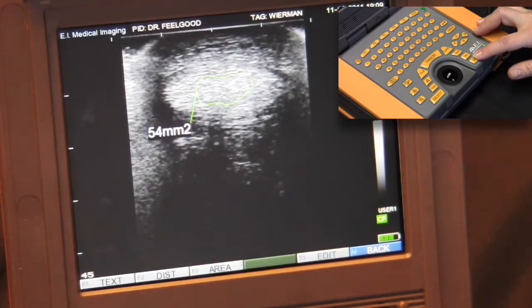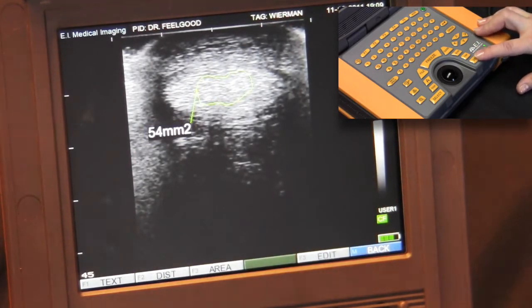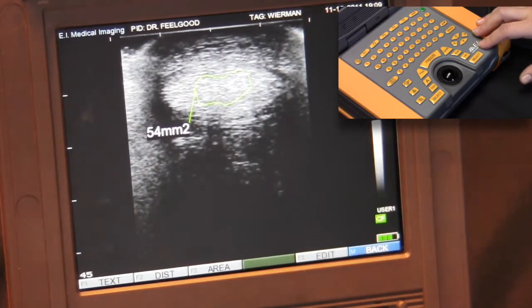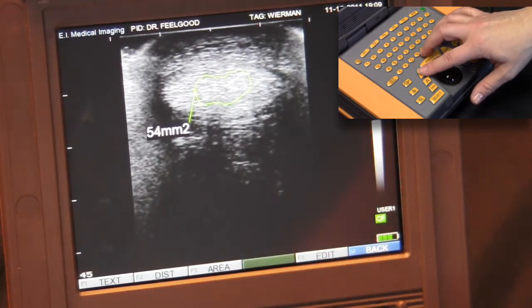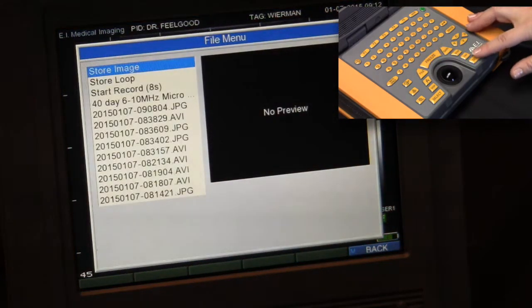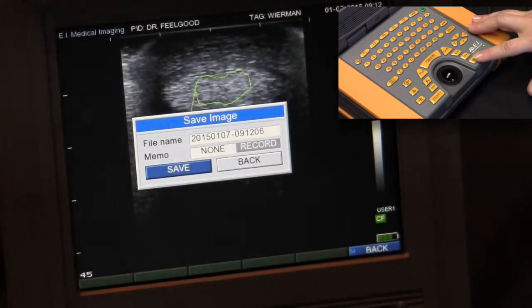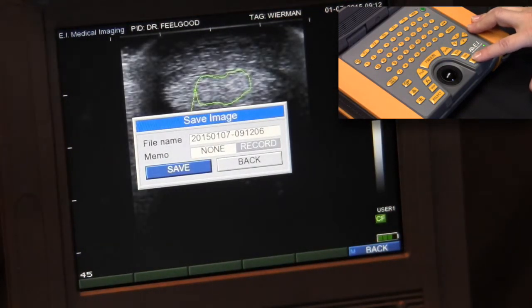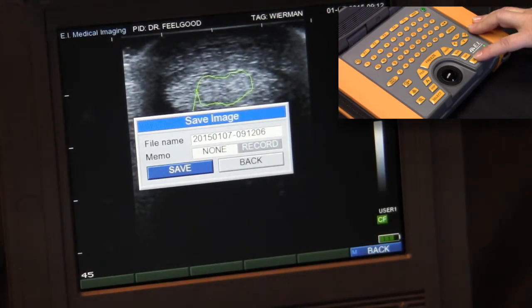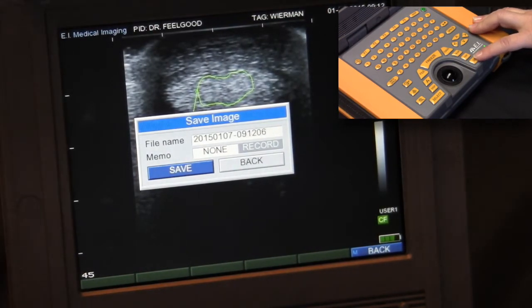Again, multiple measurements can be made on each screen. And if you would like to save a copy of this image, press the file key. Press select to store image and either rename the file, record a voice memo, or save the image with the default time date stamp as the file name.